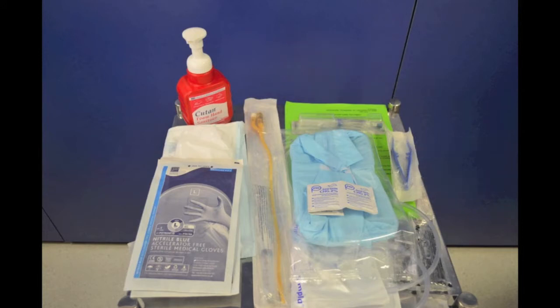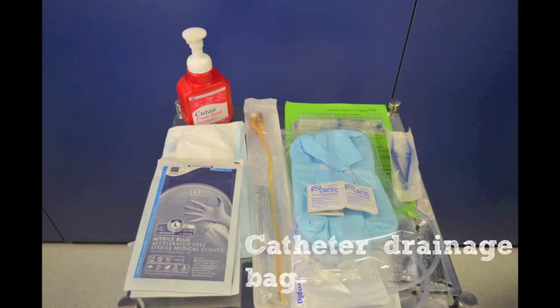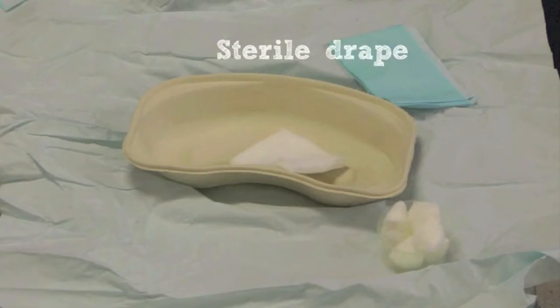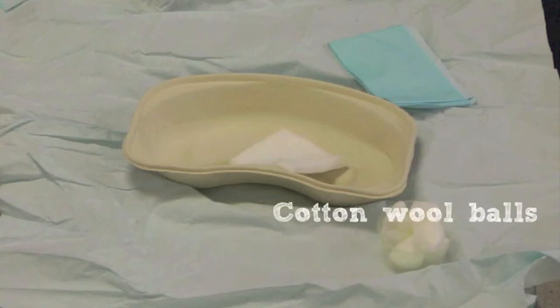forceps, a catheter pack, 2 sachets of normal saline for cleaning, 2 chlorhexidine wipes for cleaning the saline sachets, and a catheter drainage bag. The contents of the catheter pack itself are a sterile drape, J tray, sterile swabs, plastic galley pot, and cotton wool balls.